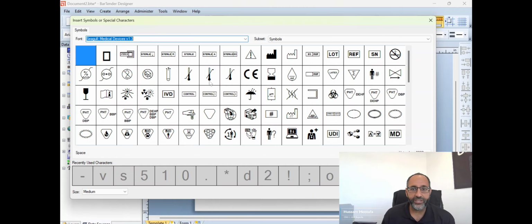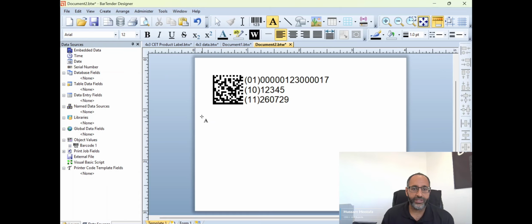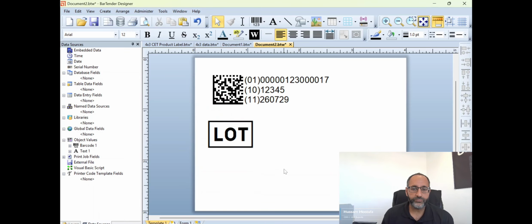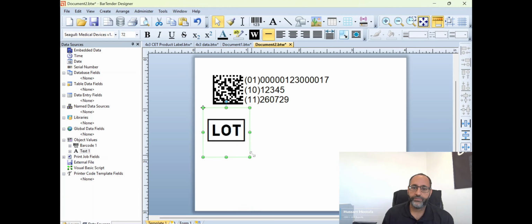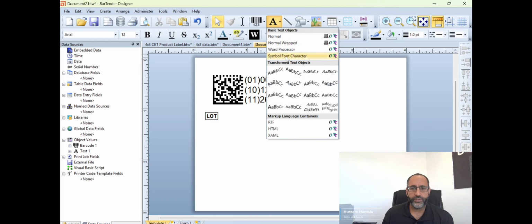So now we can just click on these symbols. So for example, lot, let's go ahead and insert the lot. So we select lot and we go ahead and press it. And now we have the lot symbol, and we can make this smaller. Let's go ahead and grab a few more symbols. Actually, just go ahead and make it smaller right now. So yeah, that's a lot. And so now let's go ahead and do some more.